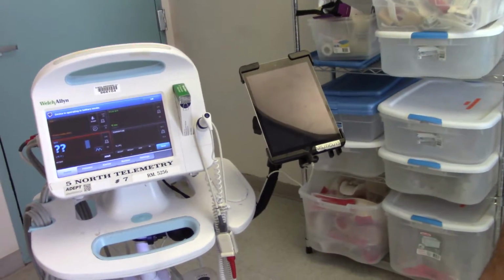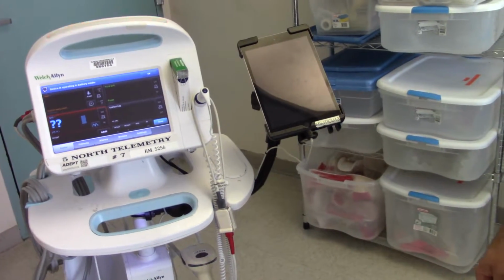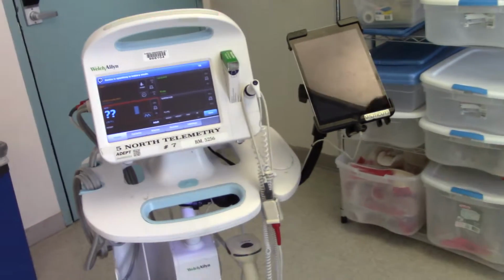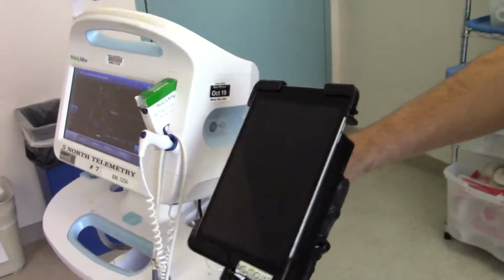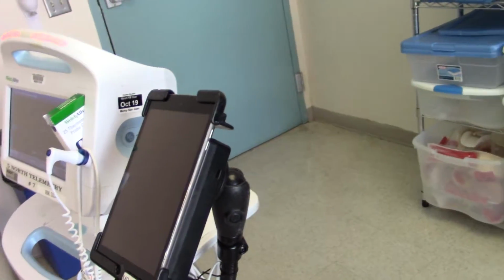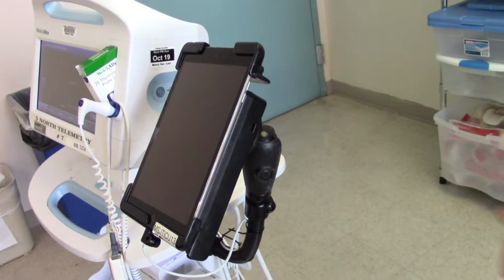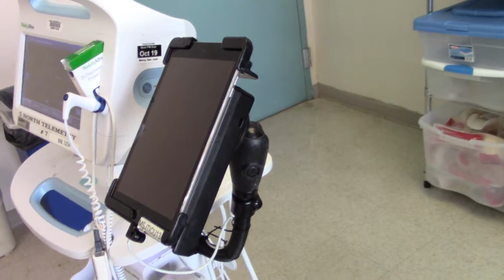And if you have something that was relatively inexpensive, then you could just have a box of them. Exactly. If it broke, just, here's another one. No big deal. And I think if you have a rigid device, I don't think it would break. That's the challenge with this: you have so many moving parts and ball joints in here that you're relying on all of them to remain stable through movement and a lot of vibration.